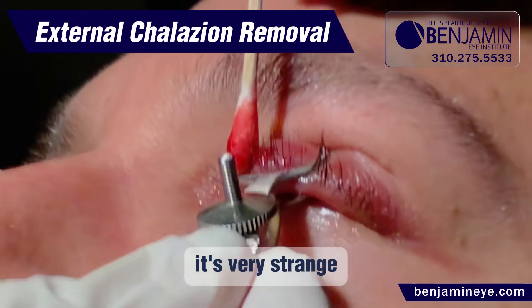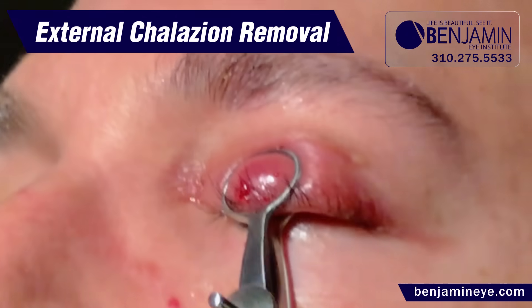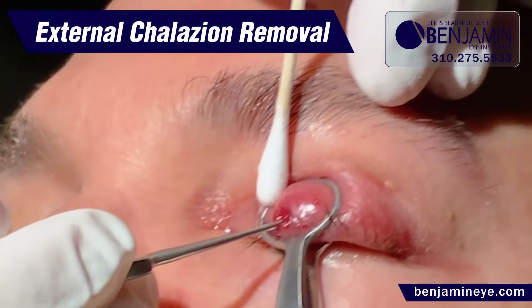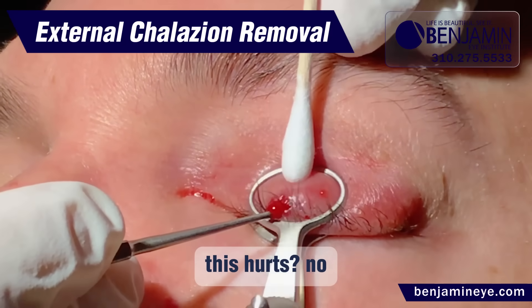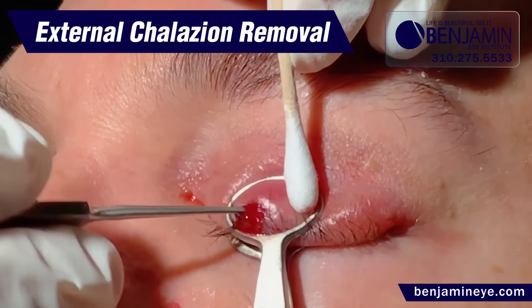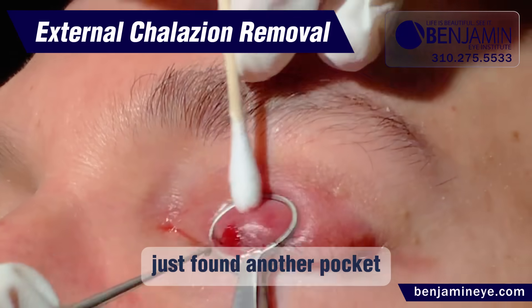It's very strange. Does this hurt? No. No, no, no. No.